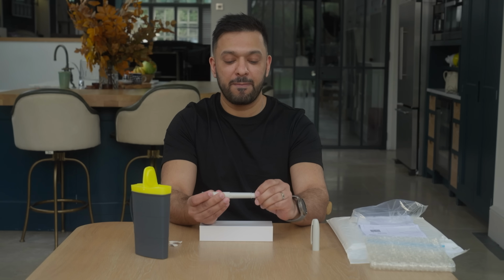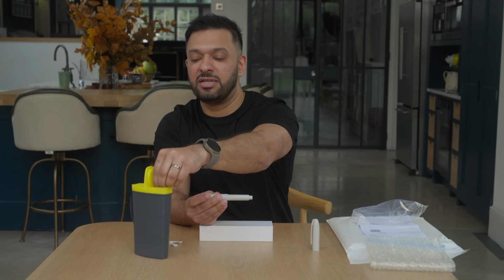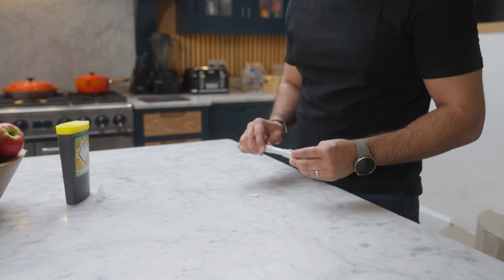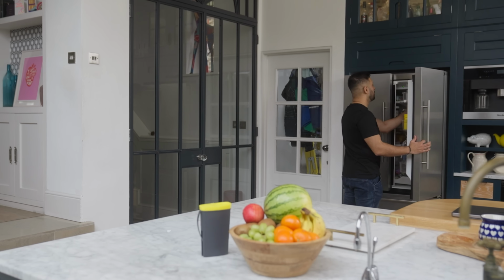Once done, remove the needle, take the plastic cap and dispose of the needle safely. Untwist and place into the sharps bin. Replace the lid back onto the cap and ideally store it in a fridge until it is next needed. This will be in 7 days' time.